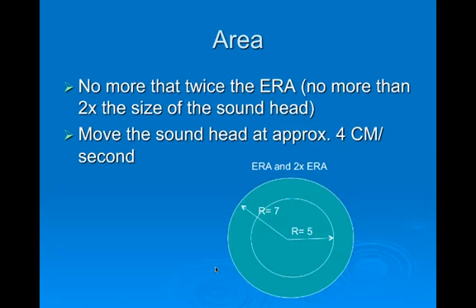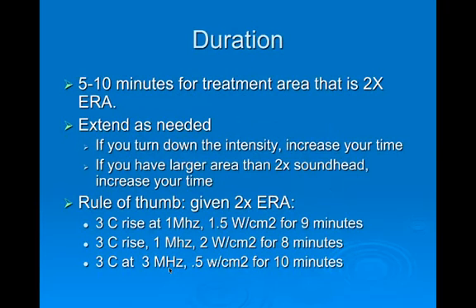If you start straying outside that, you've got to increase your time. And this is what doesn't happen: we don't automatically adjust our time for our increase in area. Okay, so a very important point to think about as you start to do these types of treatments.